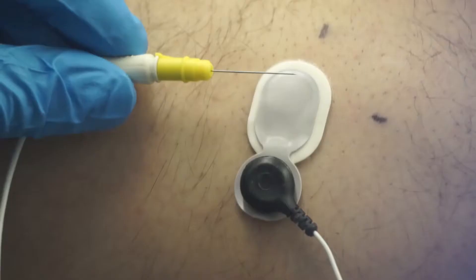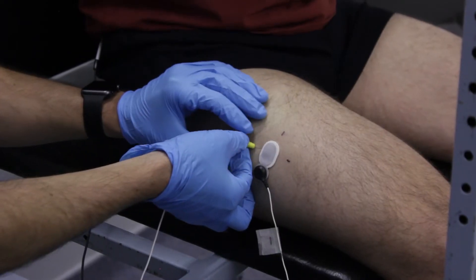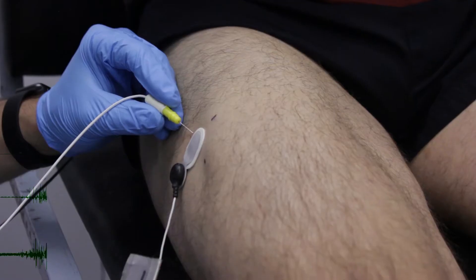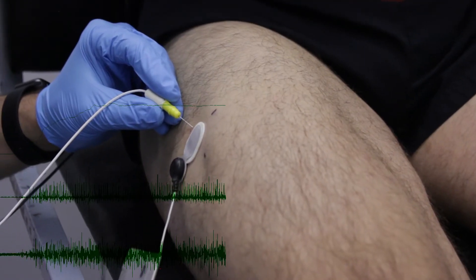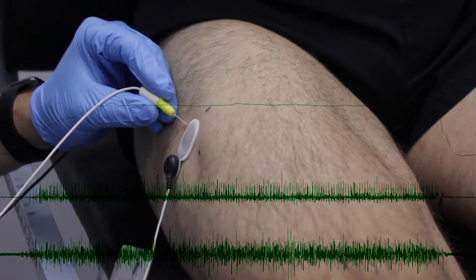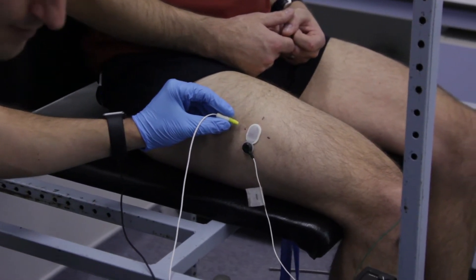With the volunteer sitting fully relaxed, the concentric needle EMG electrode is inserted into the muscle adjacent to the surface EMG electrode. The volunteer then performs a series of isometric muscle contractions, each held for 15 seconds to match a stable target force displayed on the screen.